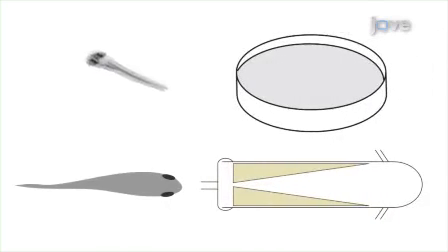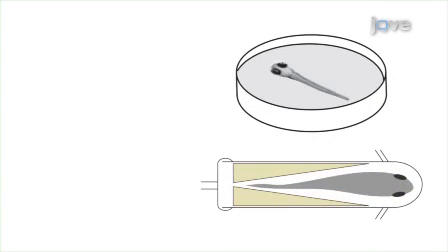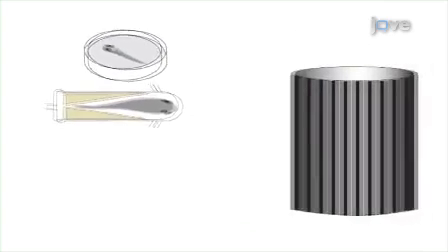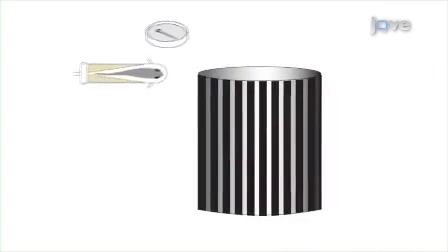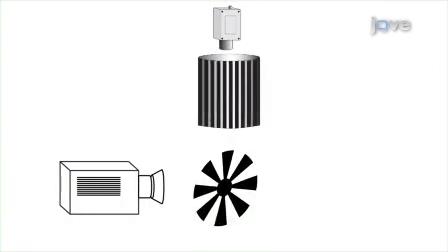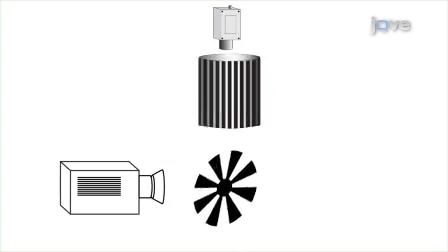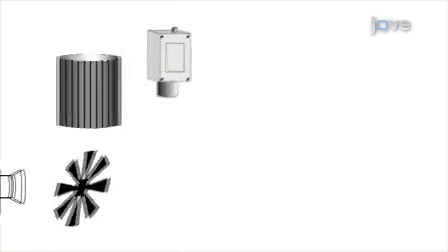Larvae are embedded in methylcellulose, and adult fish are anesthetized and fitted into an immobilization device. Next, place the body-restrained animal in the VisioTracker in the center of a drum-shaped screen. Vertical black and white stripes are projected onto the inside of this screen using a digital light projector.